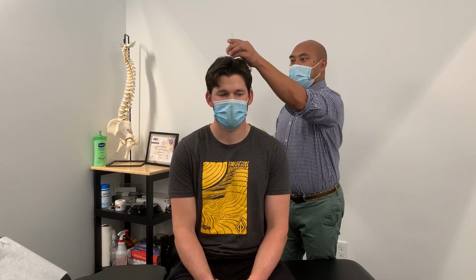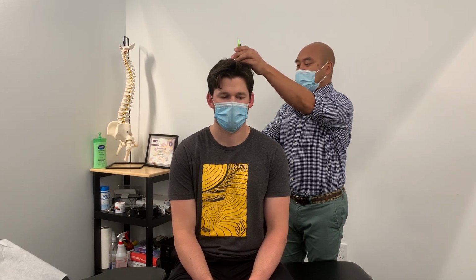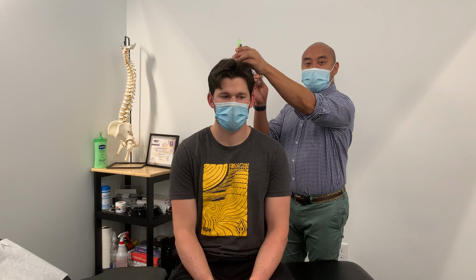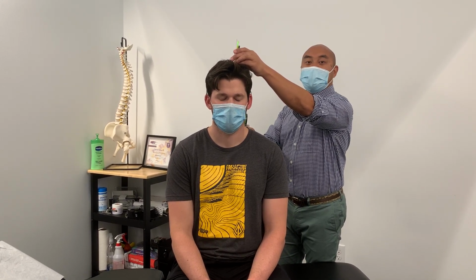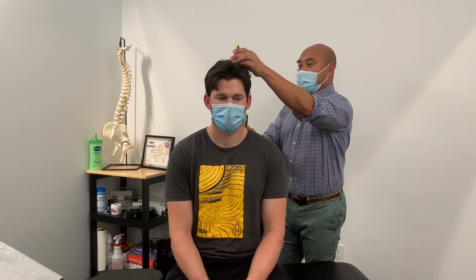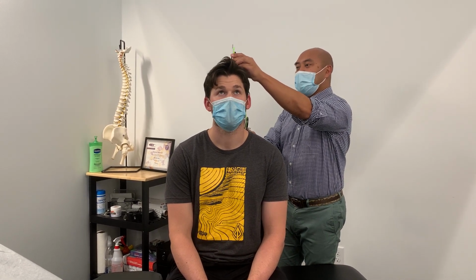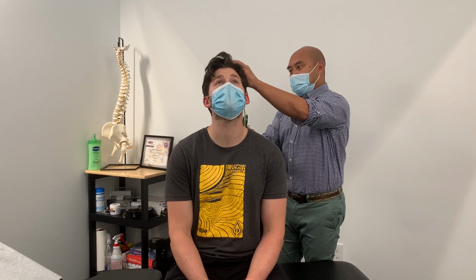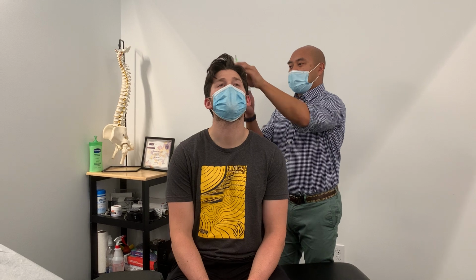For cervical extension, I'll place the inclinometers once again at the top of the head, and 1 at T1, but this time with the bottom one at T1, I'll bring it a little closer towards me so he can actually bring his head back and give him room. Once again, he'll bring his head behind him and look up towards the ceiling. I'll note the range of motion here, and then zero it out, and he'll reset. I'll also ask the patient if there's any pain or discomfort when doing so.